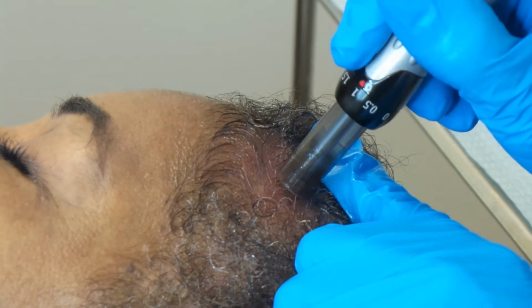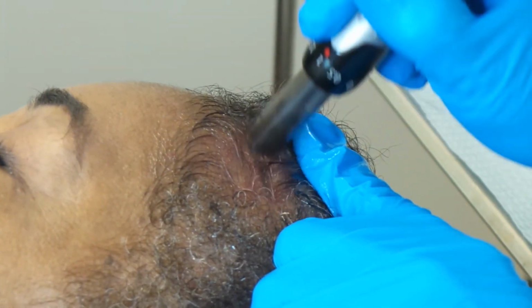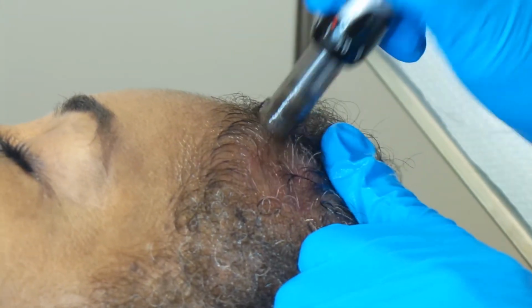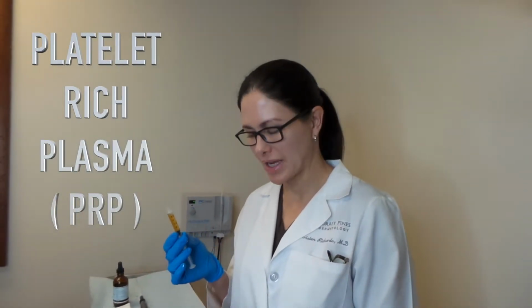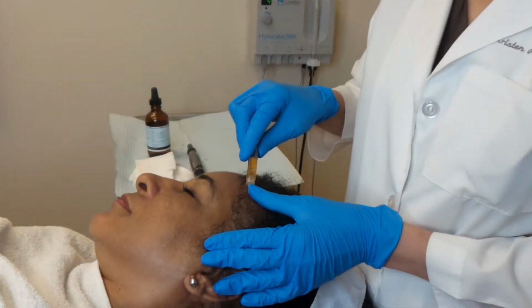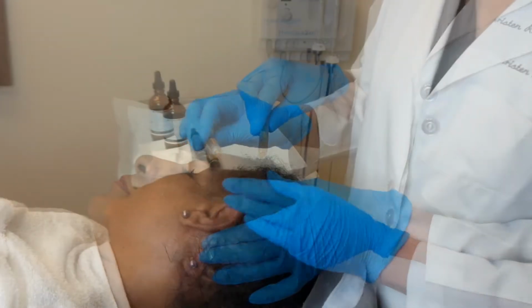So you can see that we've now reached the point where we have little tiny channels that have opened up into the second layer of the skin. Patient's still really comfortable, but we see that there's just a little bit of redness to the skin. So we're now ready to place our PRP on our patient that we've just microneedled. And literally just let it drip right out of the syringe where it came in, and you rub it in.